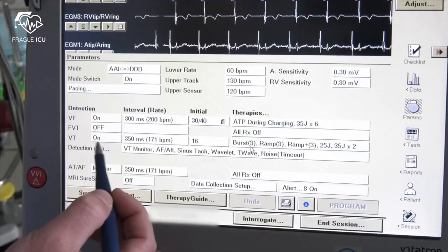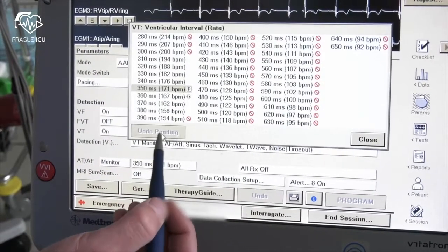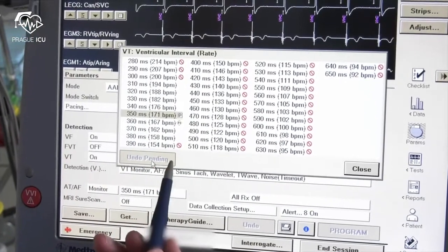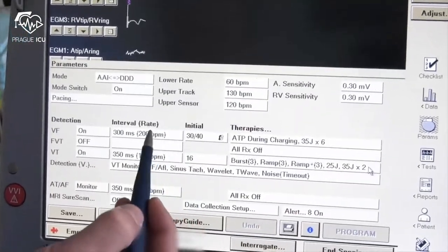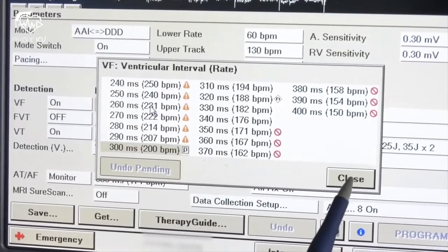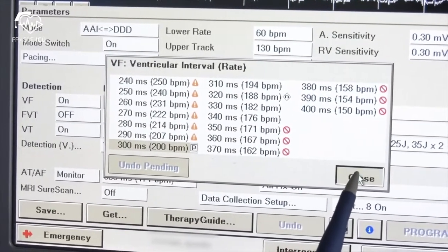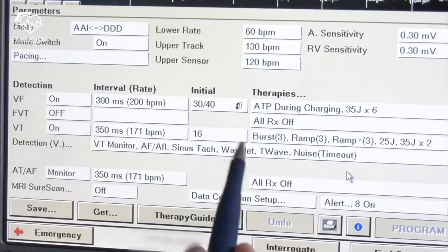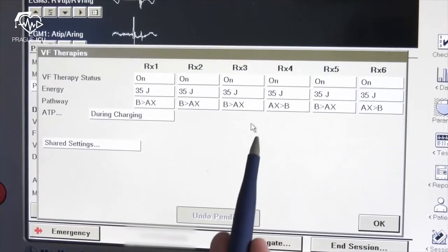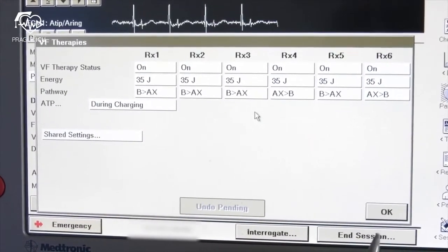In the detection area you can set detection criteria for rates of ventricular tachycardia. Basically it's a setting for two zones: one for VT and one for VF. If you click on therapies next to each zone you can see detailed settings for specific detection zones such as ATPs or shock energy. In the detection section you can see general settings of detection zones and discrimination criteria.